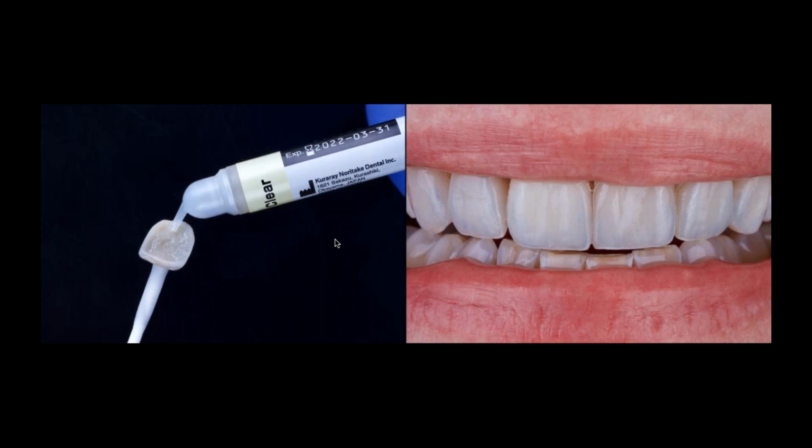There are many good solutions on the market. What is very important is to never mix components between different cement systems, okay? We don't know the chemistry of all of them, how they act or interact, so always keep it within one system. Here, for anterior restorations, I think it's mandatory to have a resin cement system that has try-in pastes. What you see here is a clear try-in paste, and I always start with the clear one. If I like it, then I go with the clear cement.